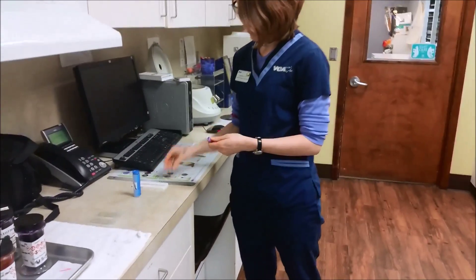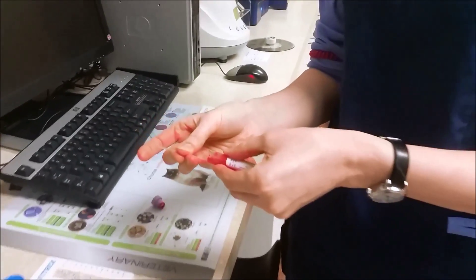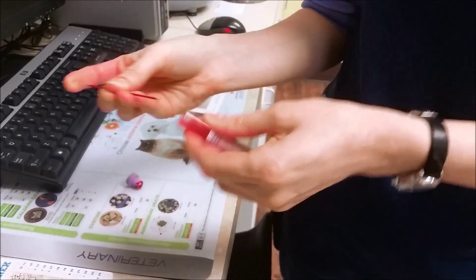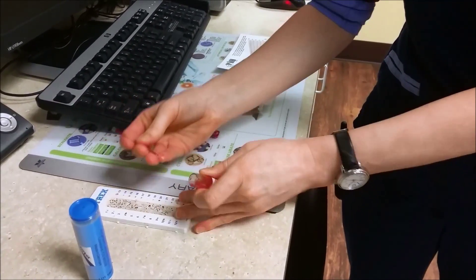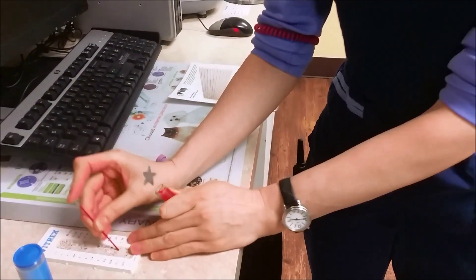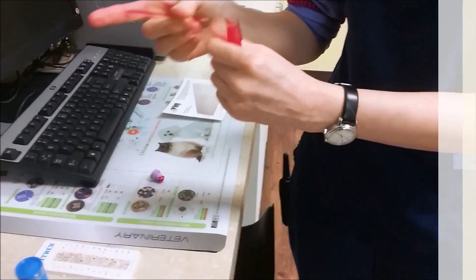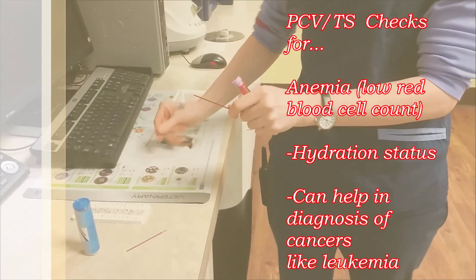We're going to fill these with blood. I want to fill that about 75% full and pack it with this clay to keep the blood sample in the tube. A couple of reasons we run a PCV is we can tell if the patient is anemic, how hydrated the patient is, or sometimes we can tell other conditions.